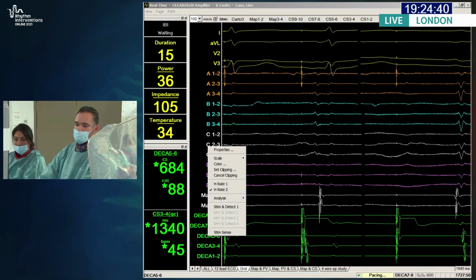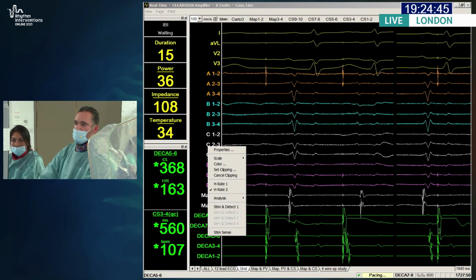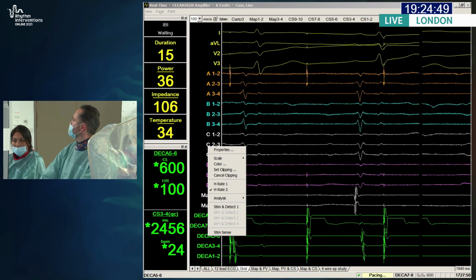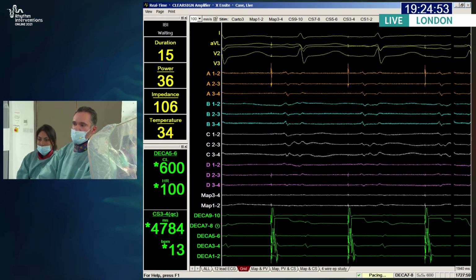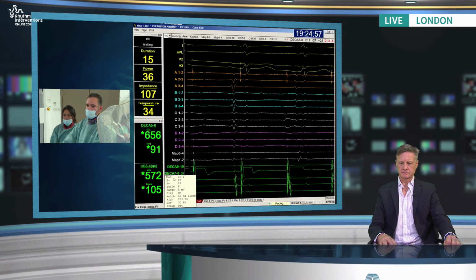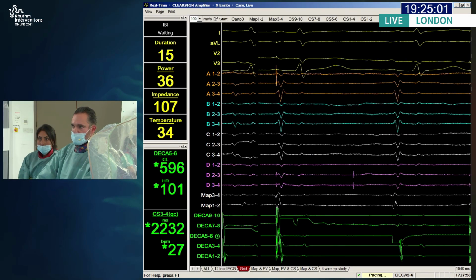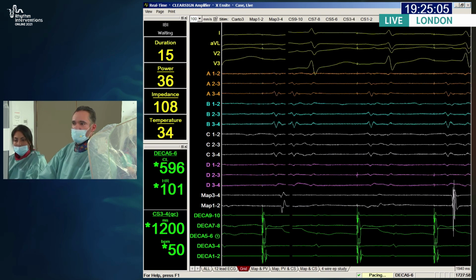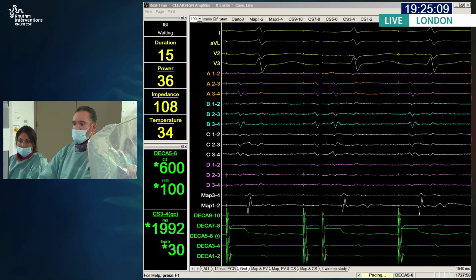Yeah, so tell us what's happening, Ross. So I'm just checking CTI block. I think we just checked right next to the line. I think, was it 176? Are you able to see the live screen there? Yeah, you've got the live screen. Okay, so I'll try and show you. Sorry, I've got an invisible geometry at the moment, but I think that's probably about 9 o'clock on the geometry. So should we measure that, guys?